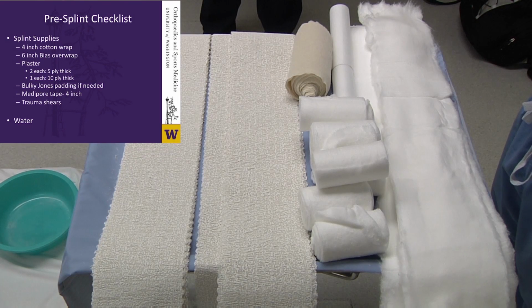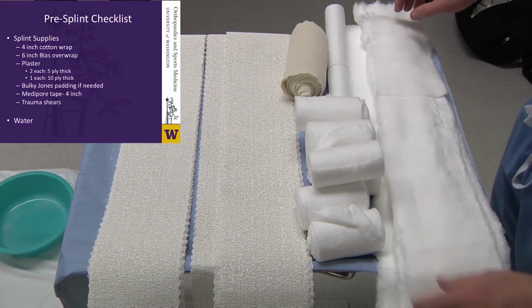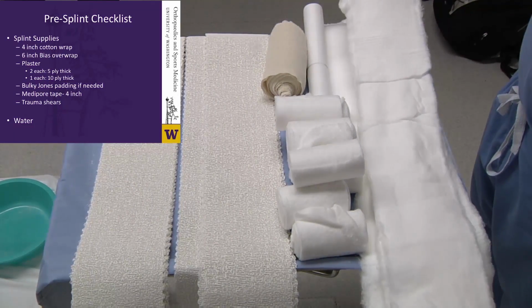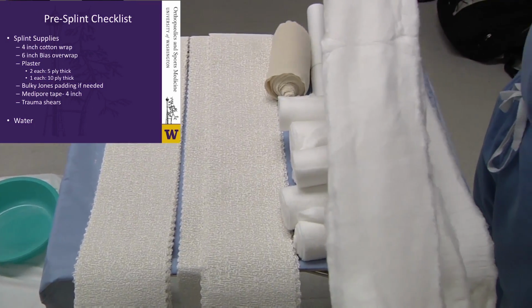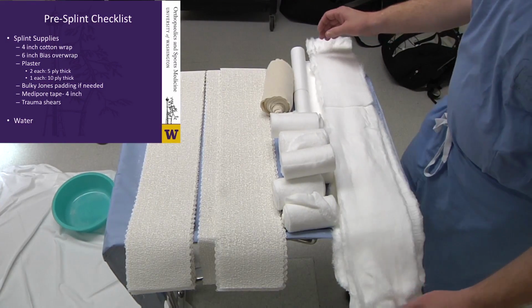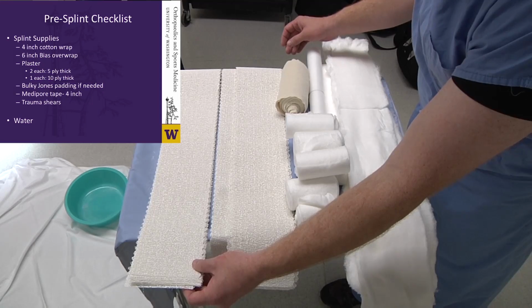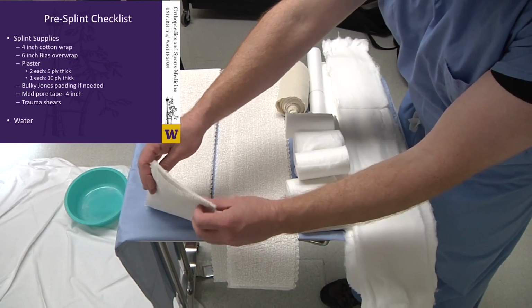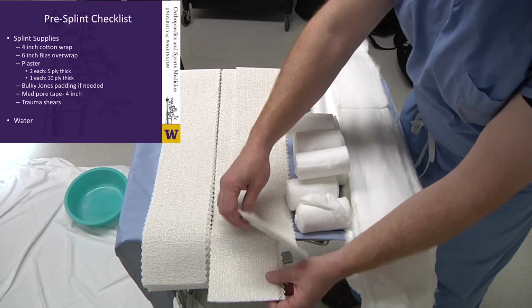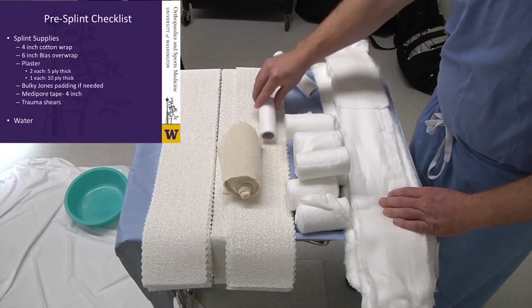So these are the splint supplies for a short leg splint that we use at Harborview Medical Center. We use 4-inch cotton web roll. We use extended, generally 4 to 6 inch cotton bulky Jones padding. We use 5 by 30 inch plaster. These are, 1 is 10 thick and then 2 are 5 thick each. We have our bias and tape.